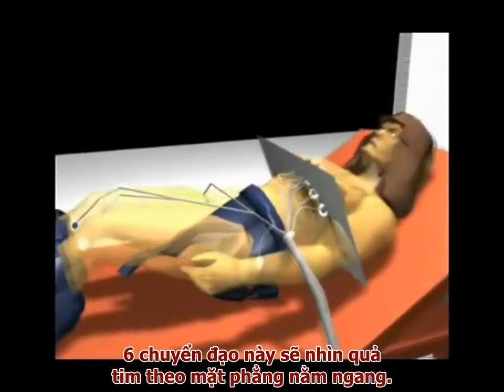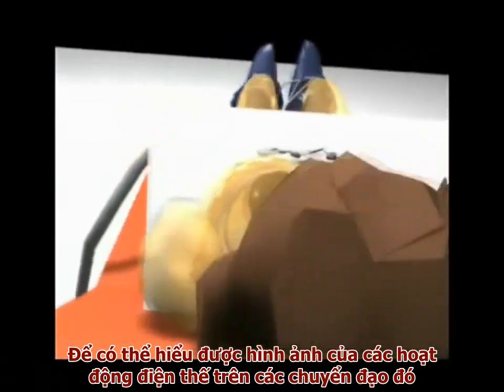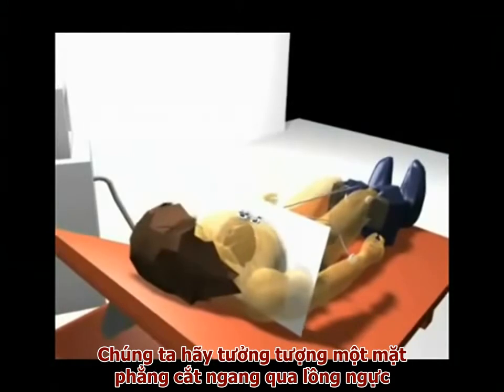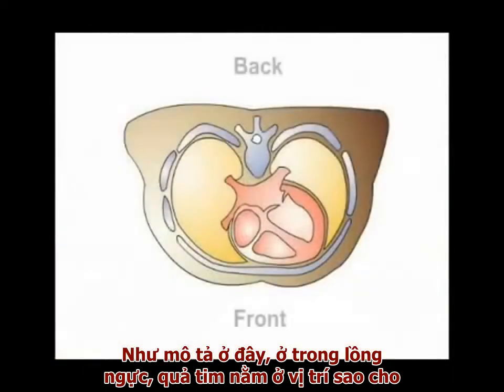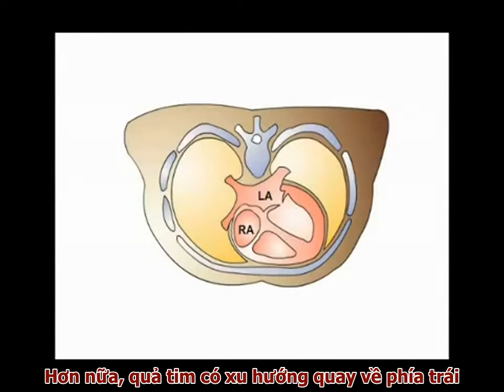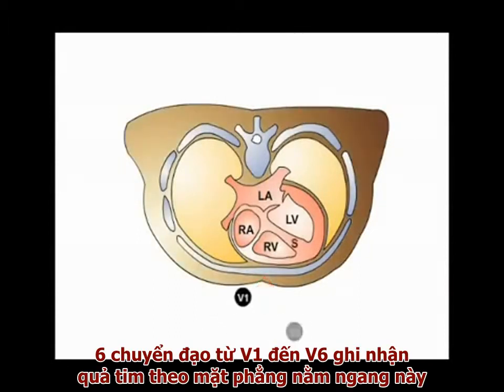These 6 chest leads examine the heart in the horizontal plane. In order to understand their view of cardiac electrical activity, we need to remind you of the position of the heart in the chest cavity. Let's examine a horizontal section of the chest taken at the level of the chest leads. As illustrated in this section through the thorax, the heart is positioned such that the right and left atria sit behind the ventricles at the back of the chest. Furthermore, the organ is rotated towards the left, so that the right ventricle lies anterior to the left, immediately behind the sternum. The 6 chest leads, V1 to V6, examine the heart in this horizontal plane.